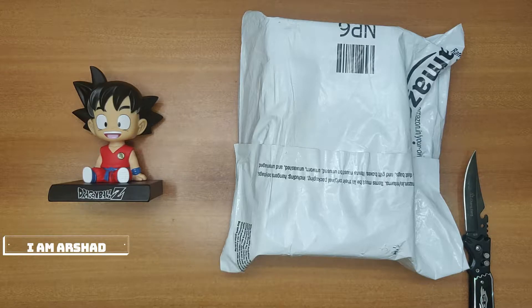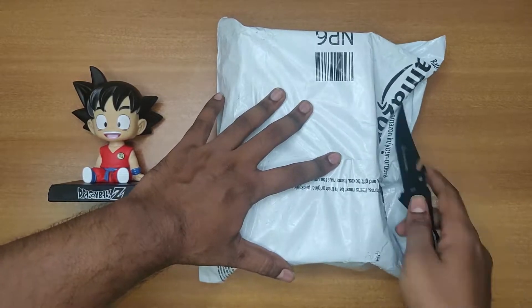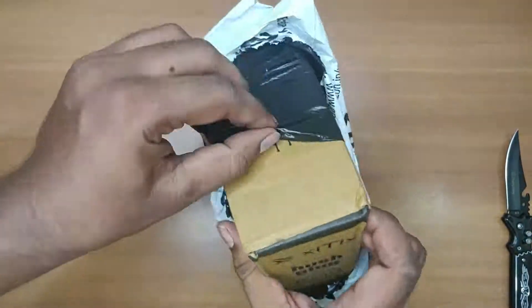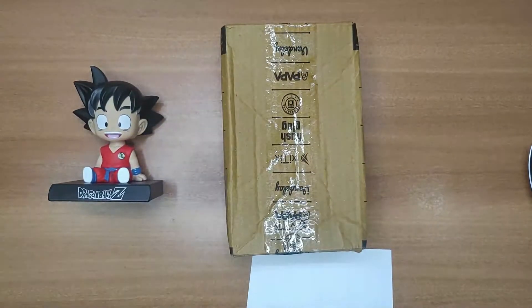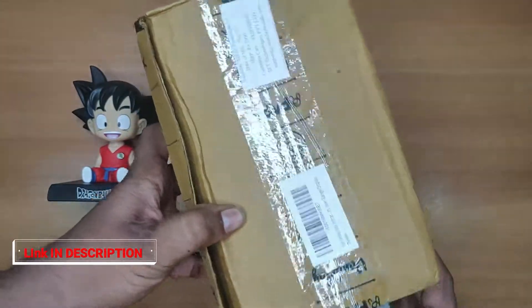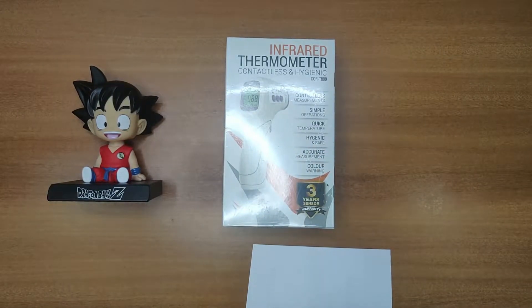Hi guys, what's going on? In this video I am going to unbox the Zytix infrared thermometer. Here comes the packaging — the reviews for this Zytix thermometer are very good, so I'm just buying it and unboxing so that you guys know how good the quality is.